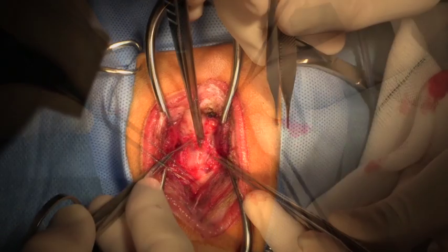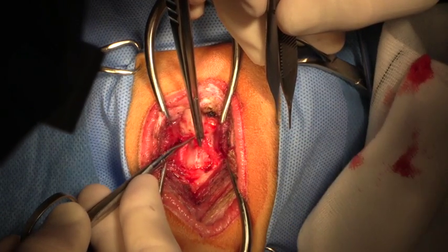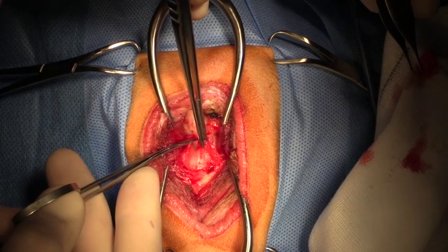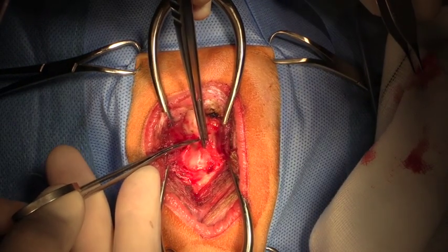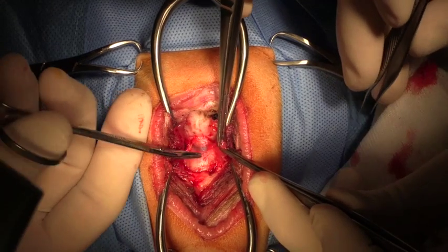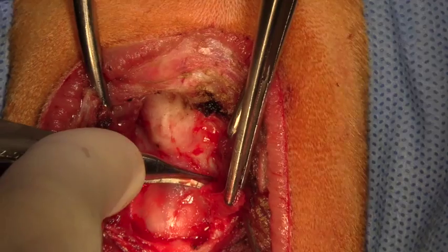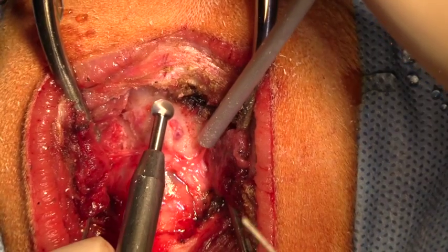We're very carefully dissecting away this connective tissue using very delicate iris scissors. Now we're further dissecting that connective tissue away and we can see the dura mater over the spinal cord.